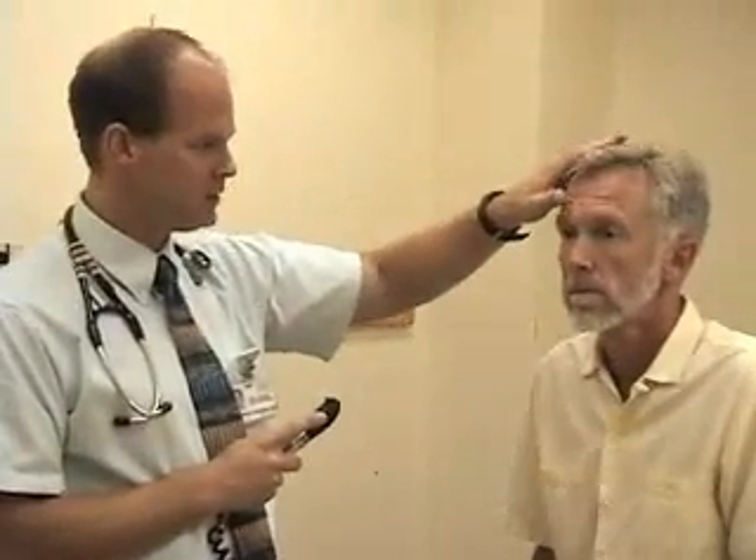I'm going to use my left hand here both for my own proprioception and to steady the patient's head. Also, that way if I bump into something, I'm going to bump into my thumb and not his eyebrow.